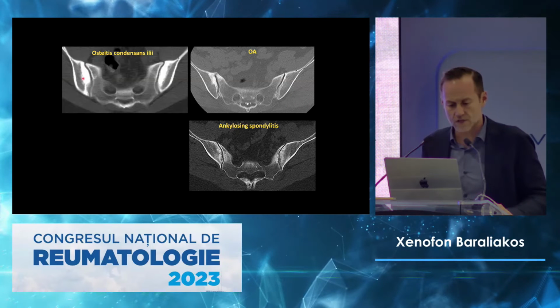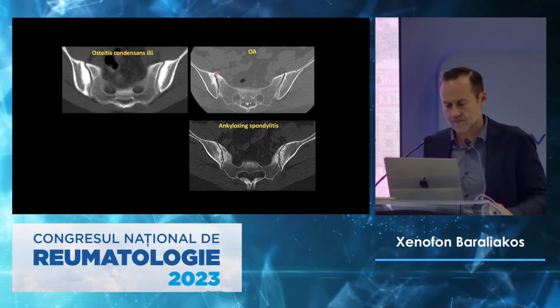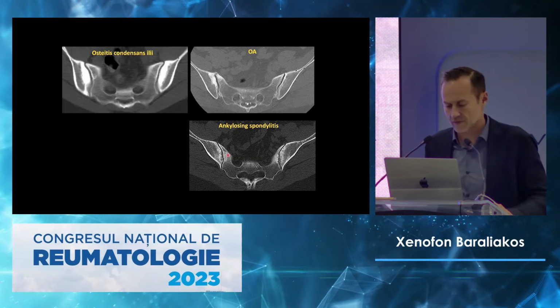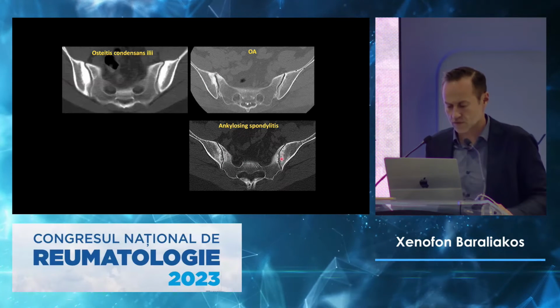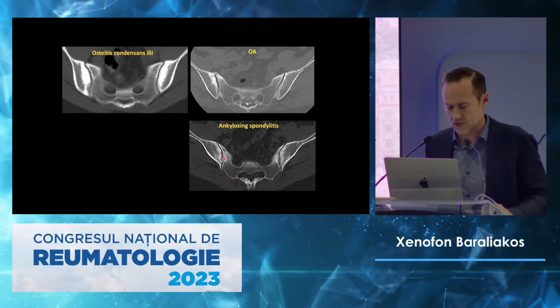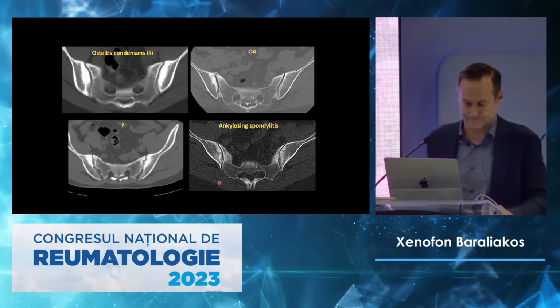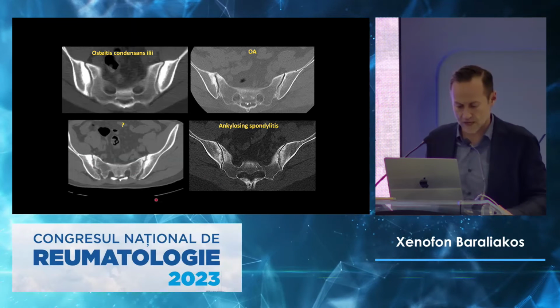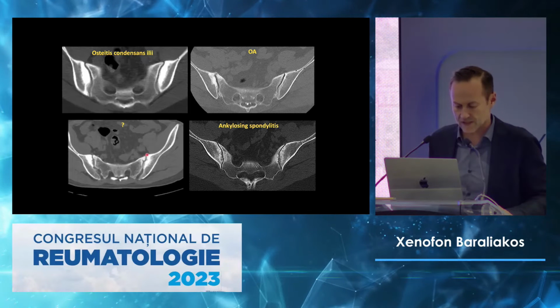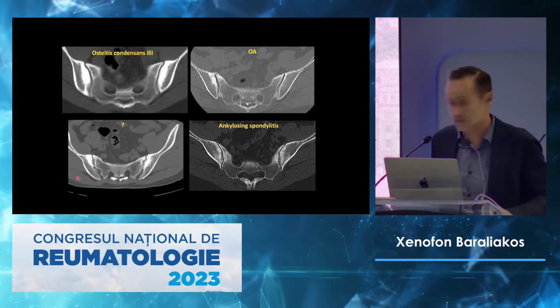Here you see there's only sclerosis, the joint line is fine, the joint space is okay. Here the same, but with a typical osteoarthritic change. And here you have a typical sclerosis, erosion, local osteoporosis, and also some joint space changes here, for example. Yeah? And you may have that patient who has everything. He has triangular sclerotic changes, has some starting osteophytes, and also has erosions in the bone.